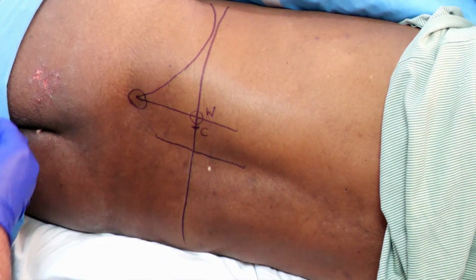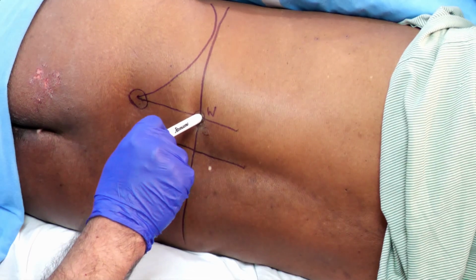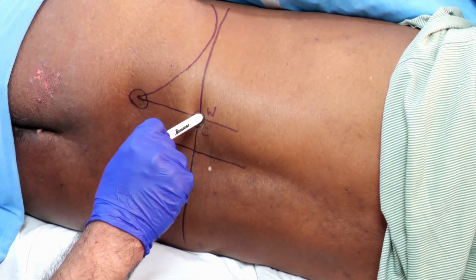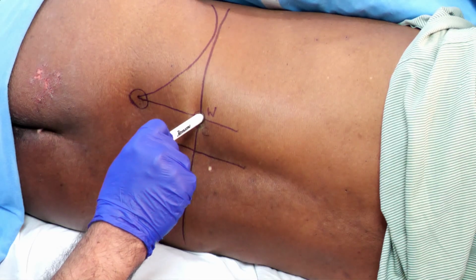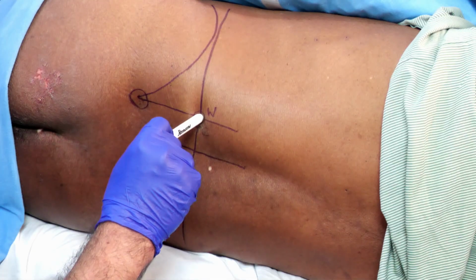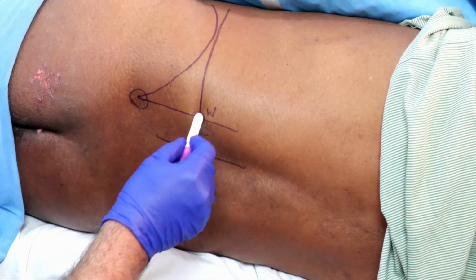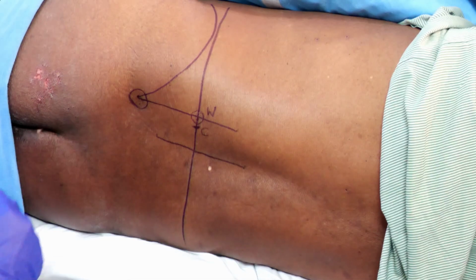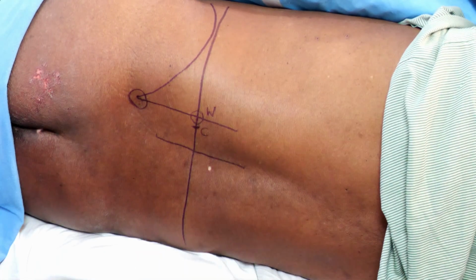So the needle insertion will be perpendicular to the back. It will be through the skin, subcutis, and erector spinae. It should hit the transverse process, and once it hits the transverse process, that's the osseous contact, beyond which 1.5 to 2 centimeters would be the lumbar plexus, and not beyond that. So minimize it to 1.5 centimeters. If you do not get any contractions of the quadriceps, you have to redirect the needle 5 degrees cephalad or 5 degrees caudal, or 5 degrees medial or lateral, and try to locate the lumbar plexus. So this would be in general the flow of the lumbar plexus block.